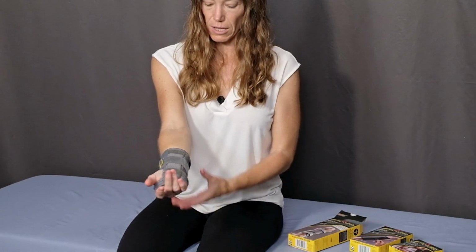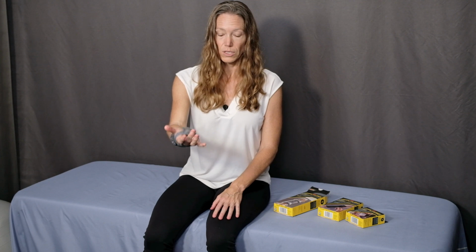Okay, wiggle your fingers a little bit, make sure that feels okay. All right, and there we have it. Now, as you can see, this provides a great deal of stability for my wrist. I can barely move my wrist at all. So this is very helpful for typing, doing light things around the house.